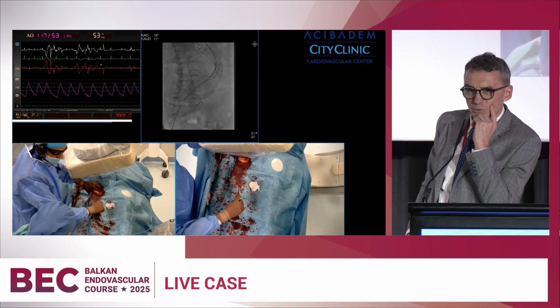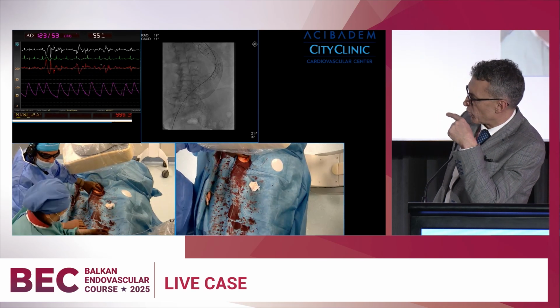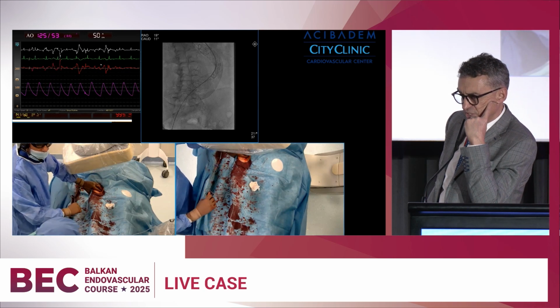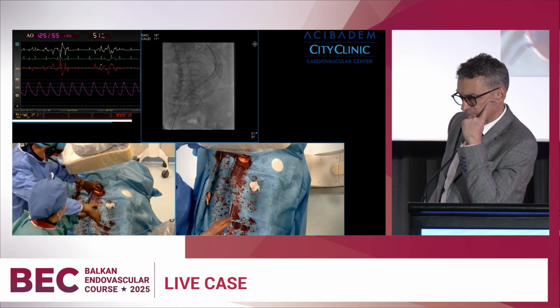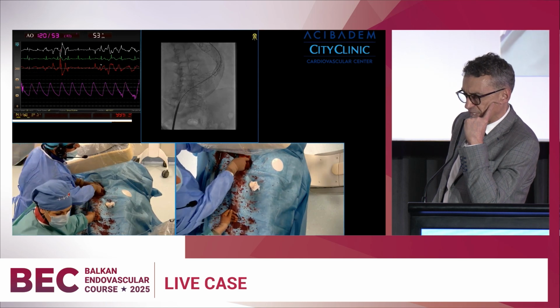Iris, what do you think? Do you think we'll need post-dilation? I would do it. Professor Matthias is suggesting a gentle ballooning. Yes. Okay, give me one Reliant. Exactly, the Reliant is an extremely compliant balloon.